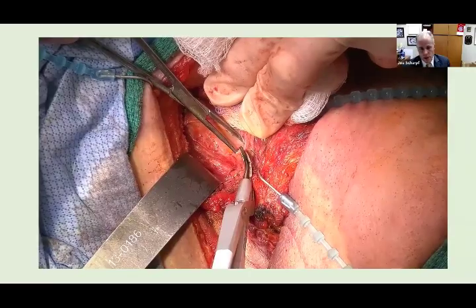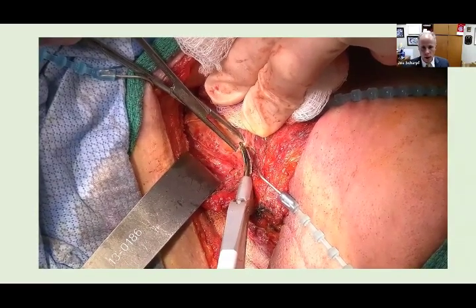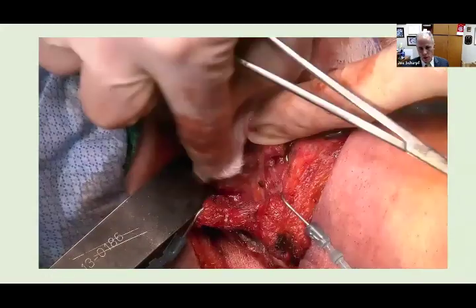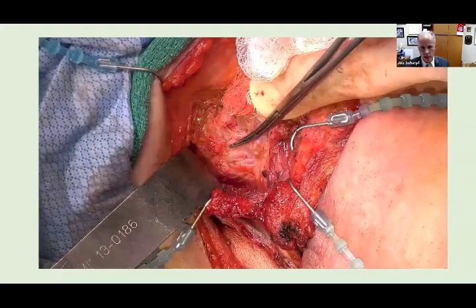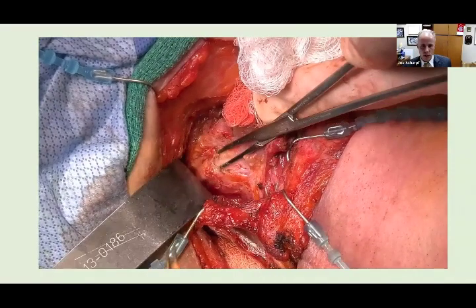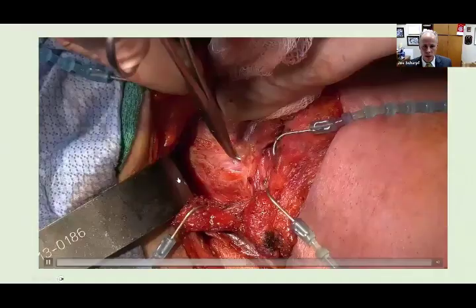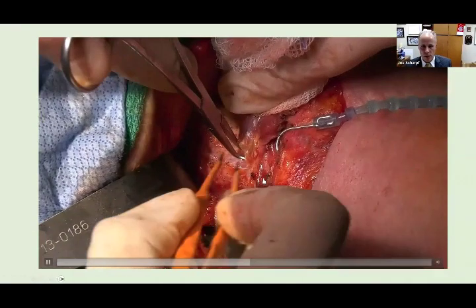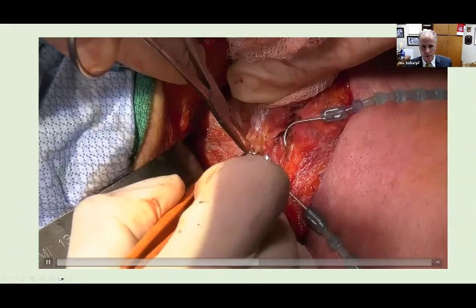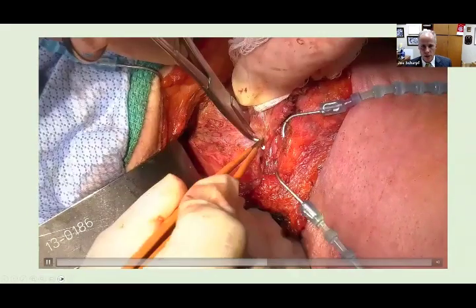It's newer for us to do these kind of anaplastic cases, and there's a lot of scarring present. But I'm trying to find the most natural tissue planes. I love jeweler bipolars for the precision that they can give to work through some of the planes. Even though the films looked pretty nice, it's very scarred in tissue. What I'm trying to do is bring these planes down into that tracheoesophageal groove. And when I get near the ligament of Berry, now we have the inferior constrictor cricopharyngeus defined. The nerve is going to come into view here.